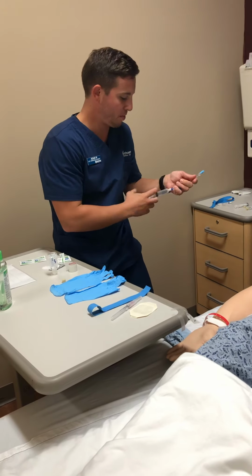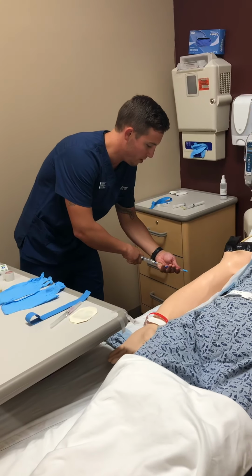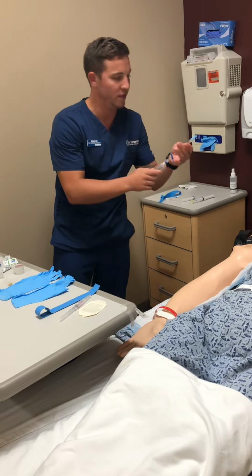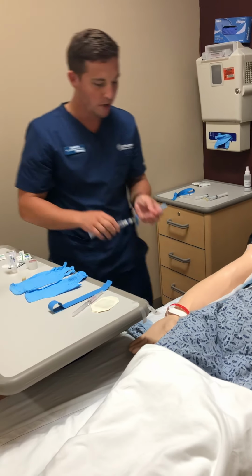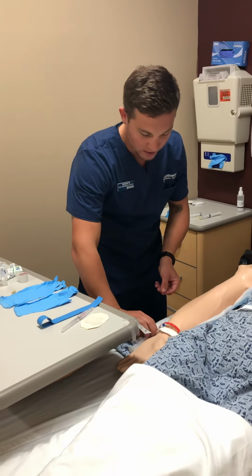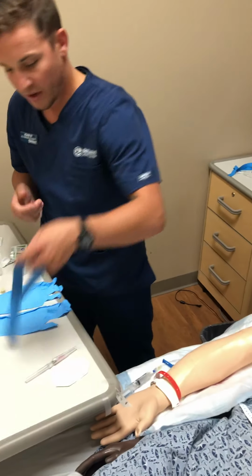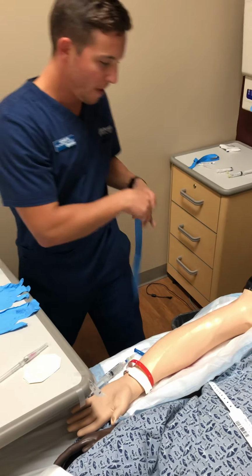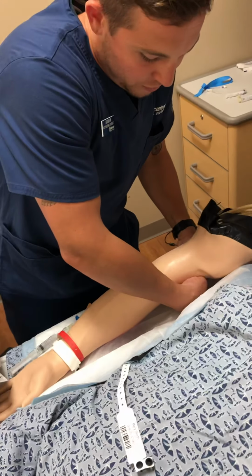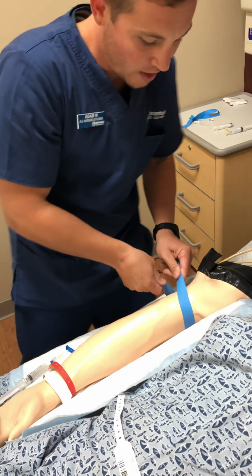Alright, I'm just going to prime our tube. Get the air bubbles out. We don't want air to go inside the veins, so there we go. We got that primed. Mary, I'm just going to set this tubing right next to you, okay? Alright, so next thing's next here. What we're going to do is we're going to have this tourniquet here, okay? So this goes around the arm here. This helps protrude your vein so that we can find the best vein to use for your IV site, okay?